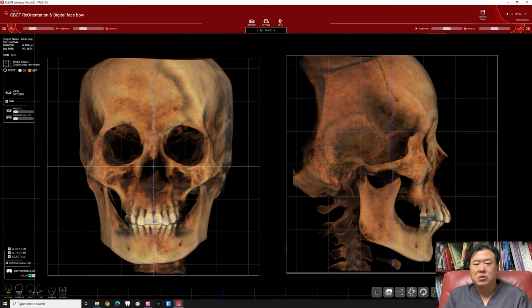The superimposition of the right and left orbital area was done. Midline was determined. Horizontal plane was found. Now CBCT is in alignment with these planes. The data is saved, and this blue line represents midline. Every time when I turn on this case, it will be in this alignment, and it is a very convenient feature.